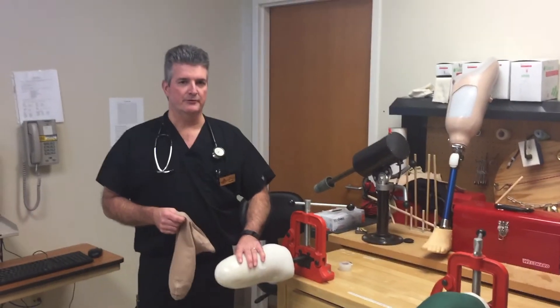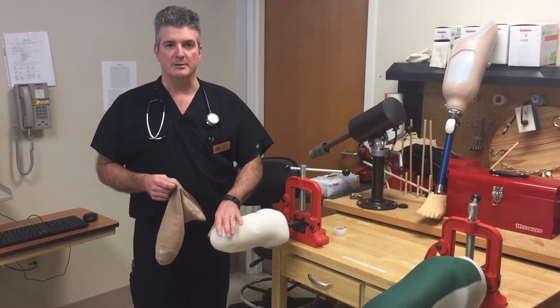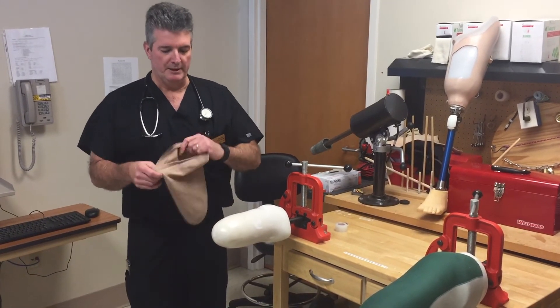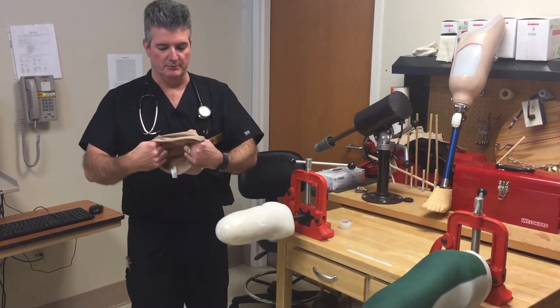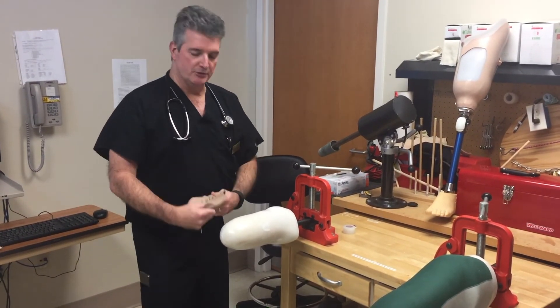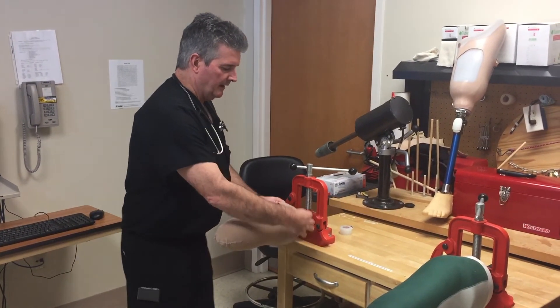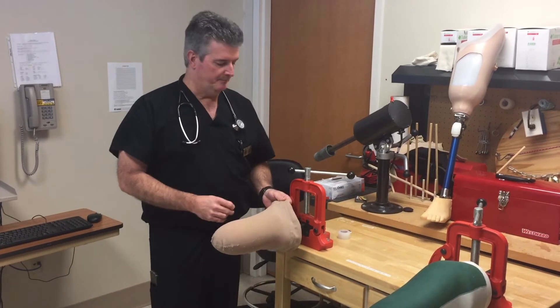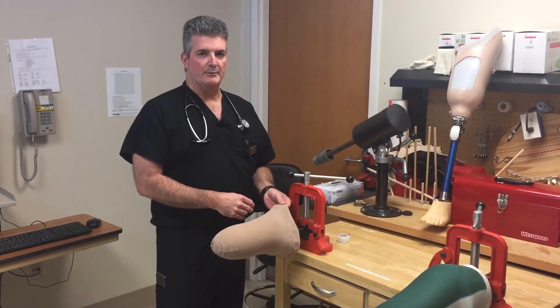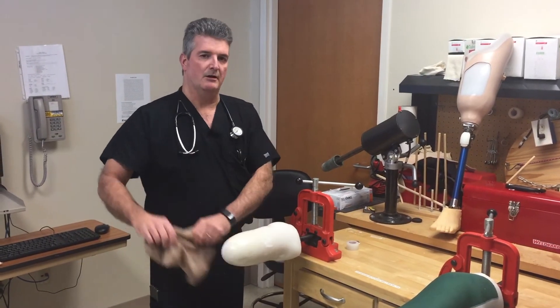Once the patient's incision is fully healed — staples, sutures, or sterile strips removed — we can be more aggressive with shrinking down the residual limb. We use a stump shrinker, which comes in sizes one through five. The patient pulls it on like a regular sock, and a silicone gel on the top creates a small bead of sweat between the skin and liner, which prevents the liner from sliding off.